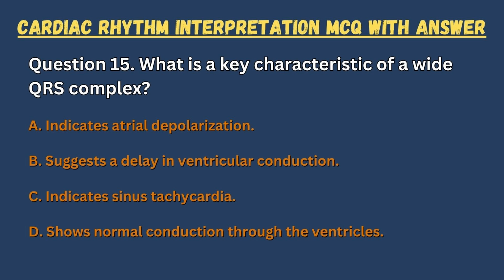A. Indicates atrial depolarization. B. Suggests a delay in ventricular conduction. C. Indicates sinus tachycardia. D. Shows normal conduction through the ventricles.